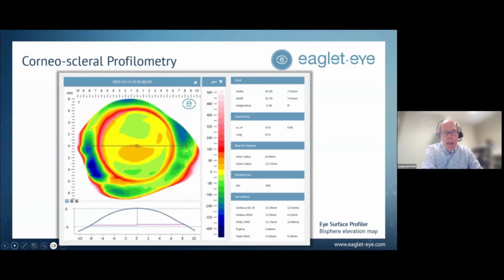You see the keratoconus, the first keratoconus, which is bulging on the inferior part of the cornea. The transition between the limbus and the conjunctiva is a little bit asymmetrical, as we can imagine. You see larger areas of red color compared to thinner ones. And on the blue part in the conjunctiva, you see where the conjunctiva is deeper, and obviously we immediately see that there's an irregularity in the conjunctival profile.